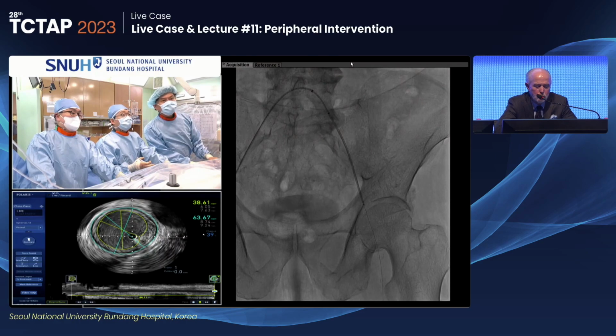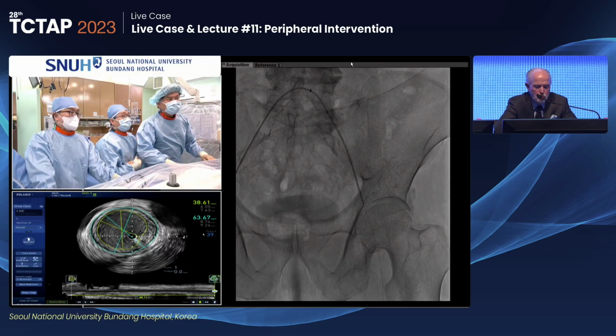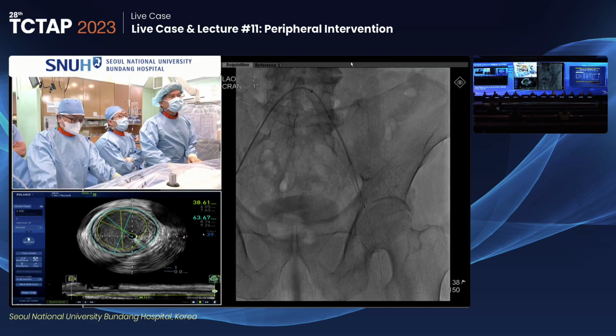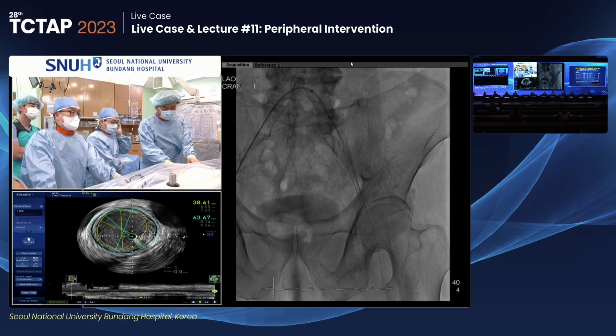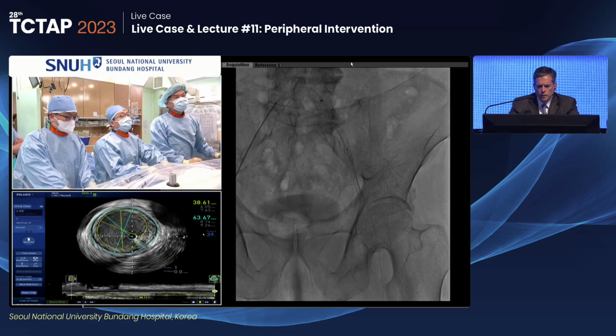Here, first, because we should not miss the distal. So I will release this one first, and if it is short above, I will add a bigger one. I will slowly start from the distal. Nice. Safest. 10 centimeter is long enough. One to one out. Yeah, I think so. I mean, it looked like that was plenty long.